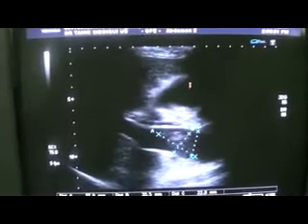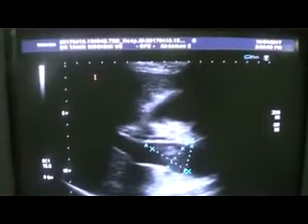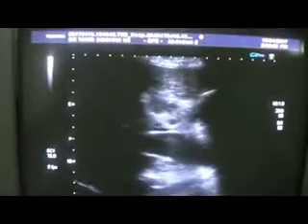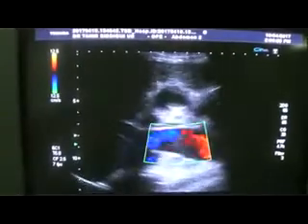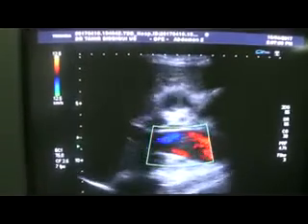Now this is the gallbladder. Let me show you the liver. This is the liver — see the outer surface of the liver, its irregular and coarse texture. There is no focal lesion seen. The only finding in this patient, apart from cirrhosis and splenomegaly, is this clot.